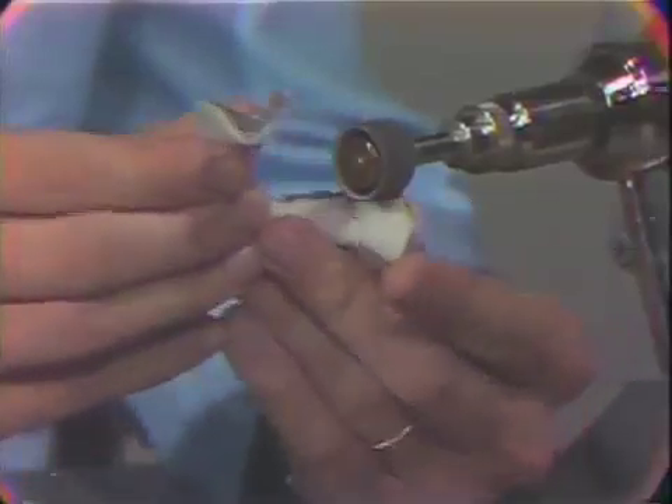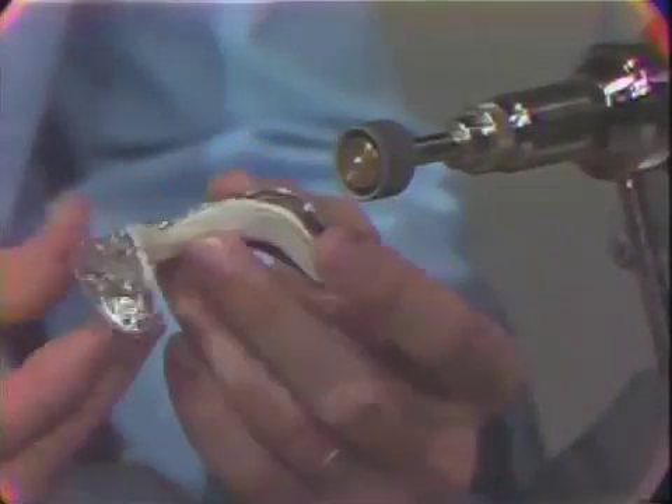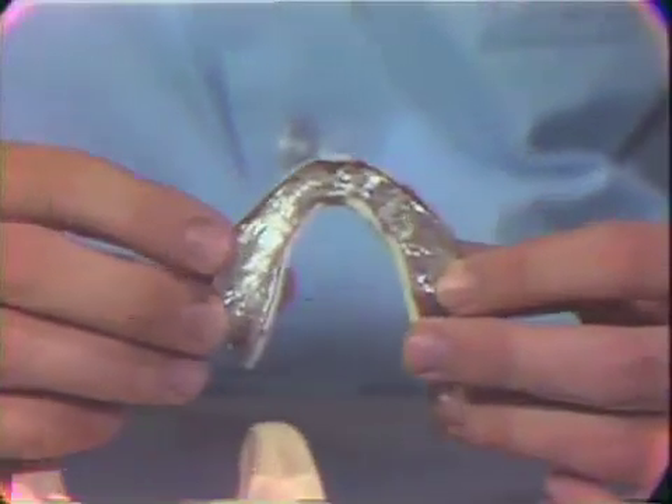For this exercise, however, we will not be performing that part of the finished base plate. You can see we have made the final adjustments.